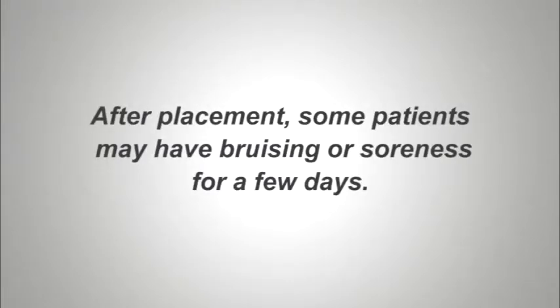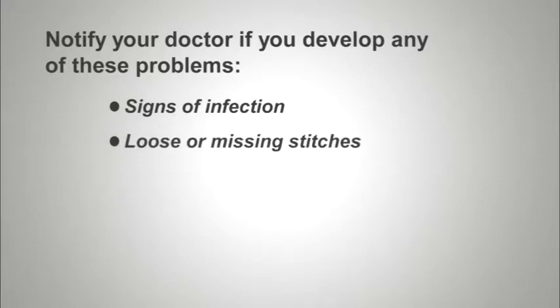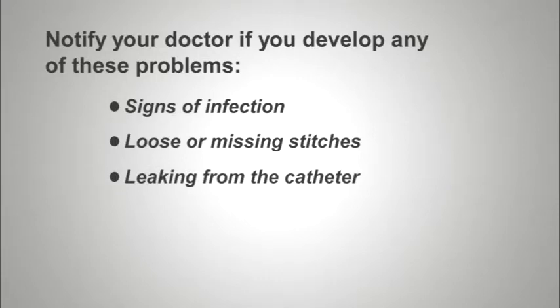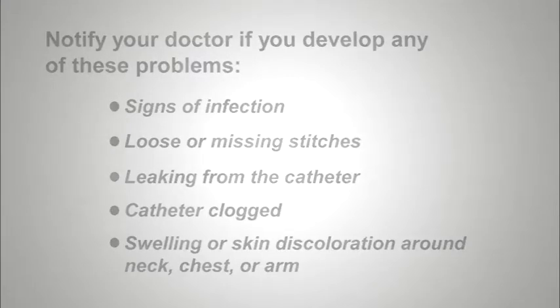After placement, some patients may have bruising or soreness for a few days. This is normal. However, notify your doctor if you develop any of these problems. Signs of infection, such as redness, pain or drainage, a fever of 101 degrees or more, or new tenderness around the catheter site, loose or missing stitches, leaking from the catheter, or if the catheter is clogged, swelling or discoloration on your neck, chest, or arm where the catheter is located.